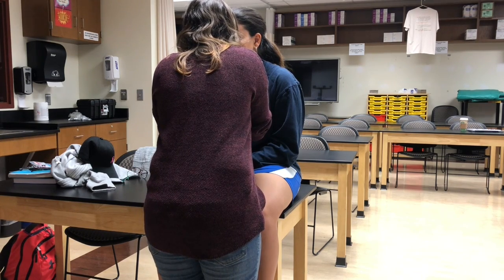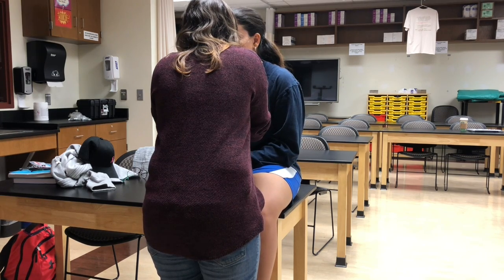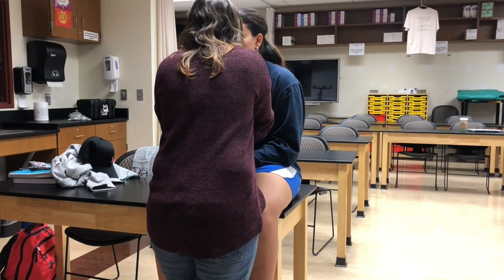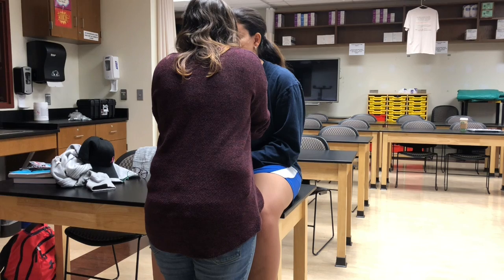Position the patient so the ophthalmoscope is held at eye level with the patient. Turn the scope and set the light. Dim the lights. Instruct the patient to focus on an object on the wall.